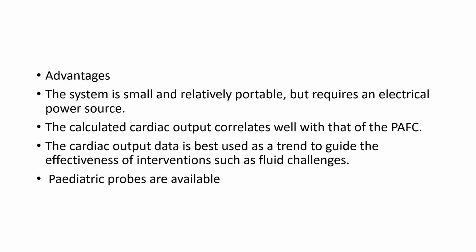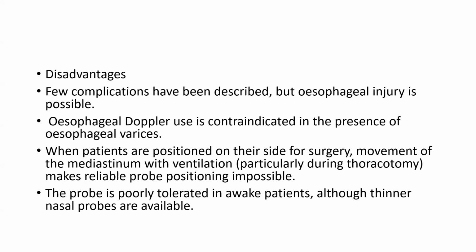The cardiac output data is best used as a trend to guide the effectiveness of interventions such as fluid challenges. Pediatric probes are available. Now, disadvantages: few complications have been described, but esophageal injury is possible. Esophageal Doppler use is contraindicated in the presence of esophageal varices.